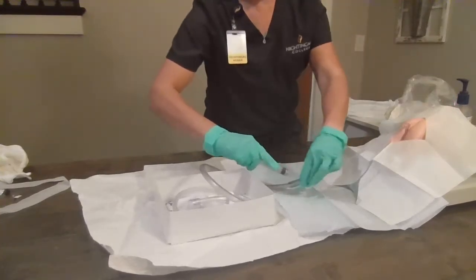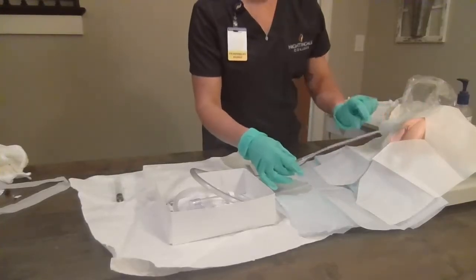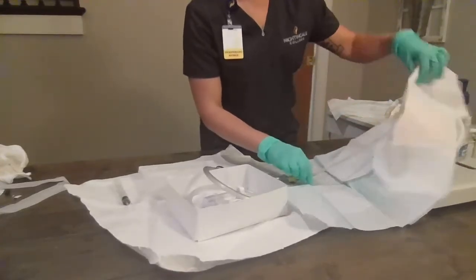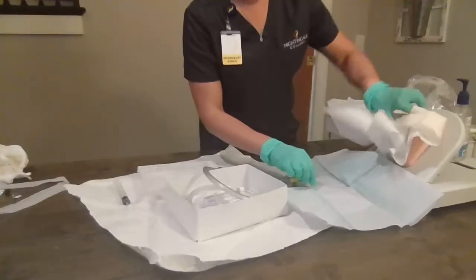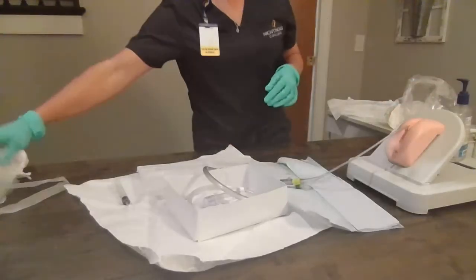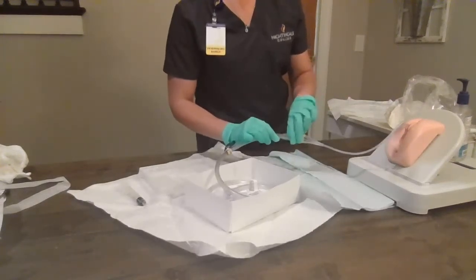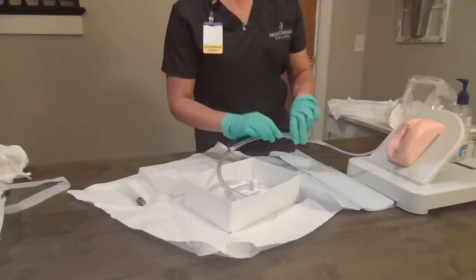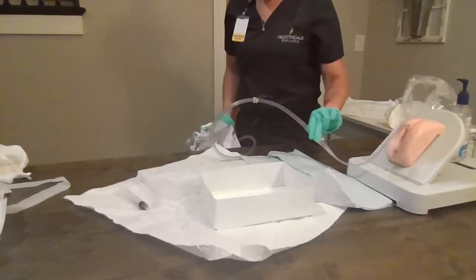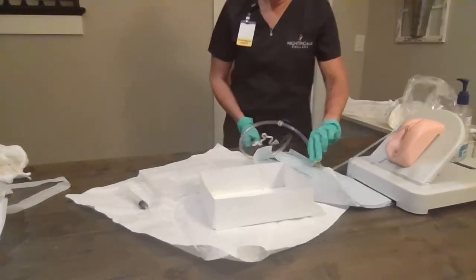Once we're inflated, we're going to pull just a little bit until we meet resistance. Ms. Smith, we are going to do a little perineal care. We are going to secure the tube to her inner thigh, and we're going to hang our bag on the side of the bed on a non-movable part, making sure that it's below the level of the patient.